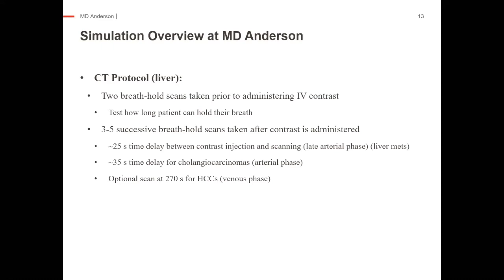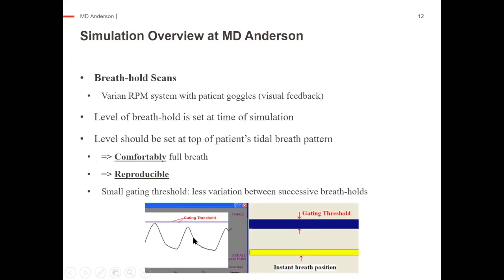And I'll have a couple of slides on that here in a minute, but we either treat free breathing, where we treat during the entire breathing process, and that's if the target motion is less than 1 cm, or if it's greater, then we treat them with breath hold. So you'll see this threshold. I'll have another slide on it that shows it, but only when they hold their breath in this level will we beam on.